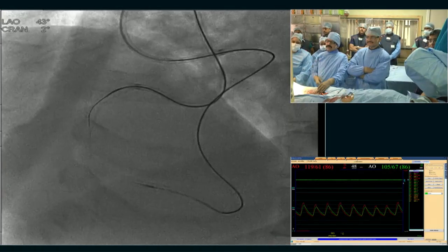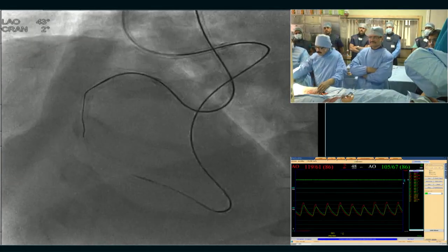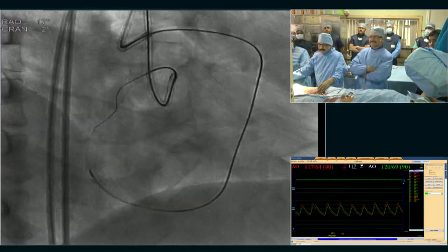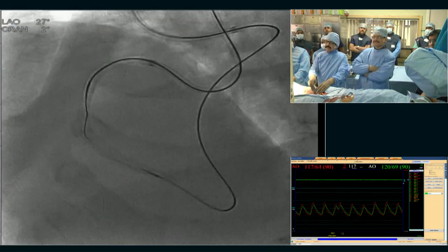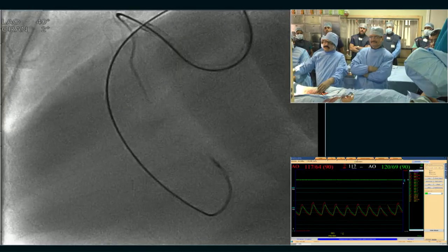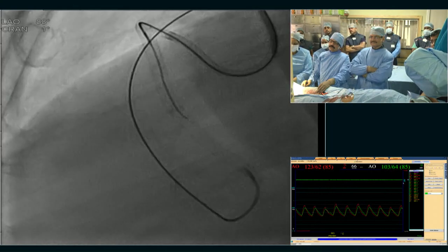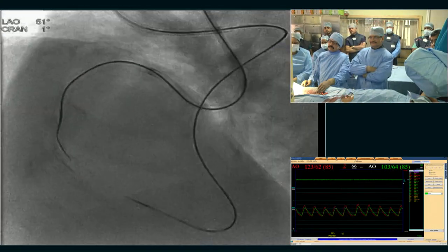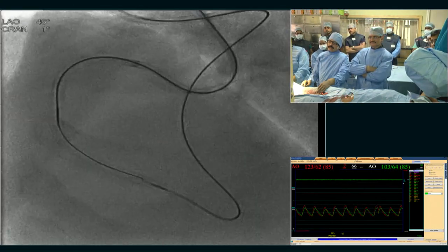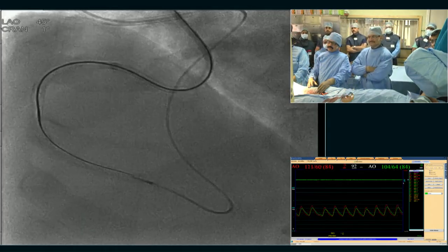And we wanted to do a reverse CART, but one of the techniques I usually follow, if I feel an in-stent restenosis track, I quite often do a Rendezvous technique, which I tried in this case. But finally, a Gaia 3 could cross antegrade. Almost we tried a Rendezvous technique, but we could not succeed.